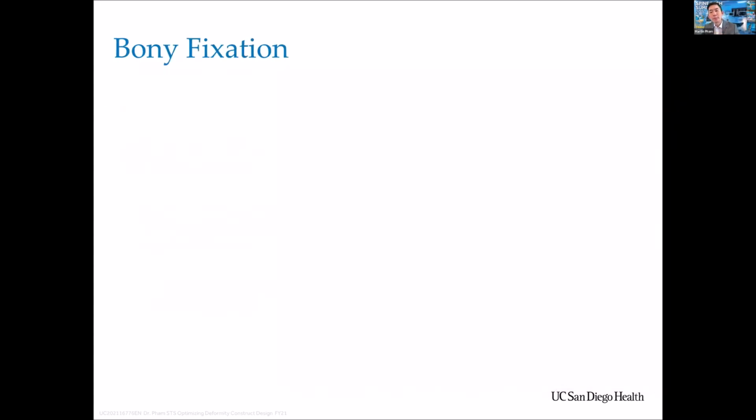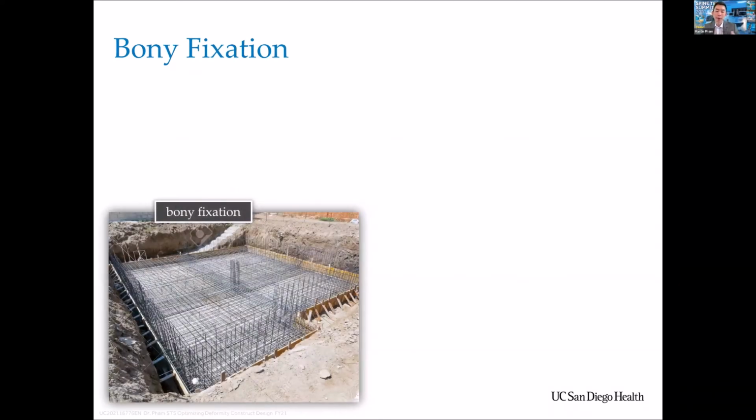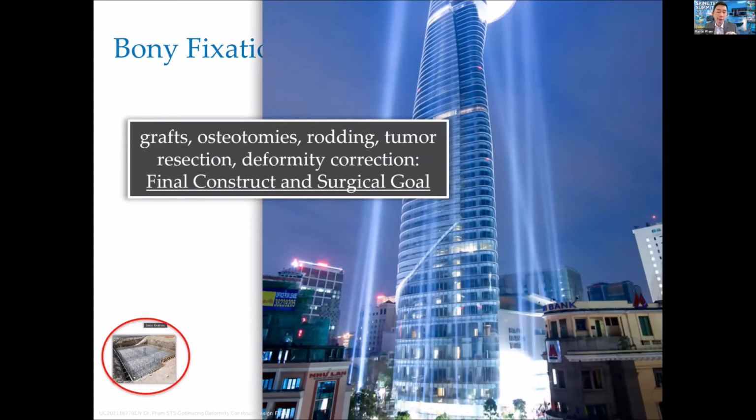And in this way, the bony fixation, and a lot of you have already heard me tell this analogy already, but I see bony fixation in putting in pedicle screws like pouring the cement or pouring the rebar for a building, right? It's not the surgery itself. It lays the foundation, but the rest of the surgery, the grafts, the osteotomies, the deformity correction, that's where the surgical goal is accomplished to make your patient better. And so if you can reduce the amount of time or the amount of frustration or the amount of troubleshooting that is spent on just putting in the screws, more time can be spent on actually fixing the deformity.